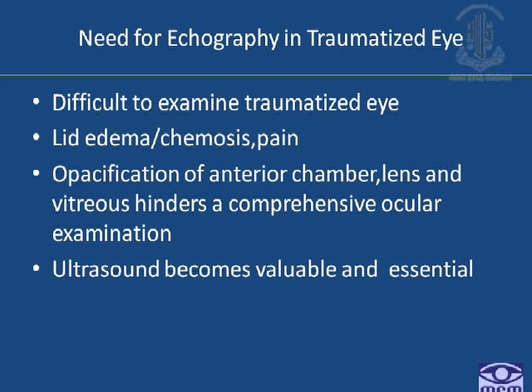So he or she is experiencing pain. Moreover, there is opacification of the anterior chamber. The lens may be opacified. He or she may be harboring a traumatic cataract, and this might hinder a good examination of the retina and the optic nerve head and the periphery, and also you cannot give a diagnosis or prognosis of the patient. So here is the role of ultrasound, and it becomes valuable and essential.